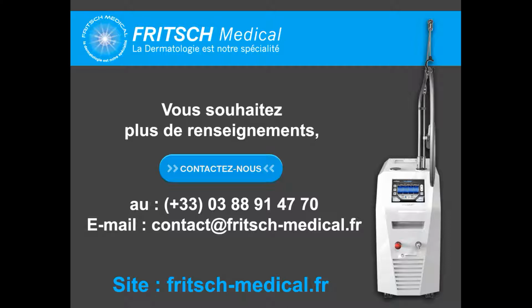So sometimes you have to induce a purpuric reaction. With a very low pulse duration, between 3, 4, 5 milliseconds, you induce a purpuric reaction, so you see immediately where you are. With a thermal coagulation, you don't really see where you are, so you have to push the gel to know. Sometimes you don't need 2 passes, because the more passes you make, the more you induce thermal effect and edema, and it's not necessary.